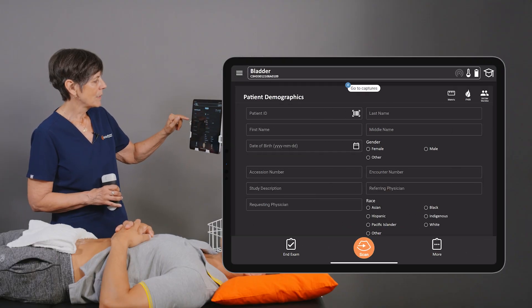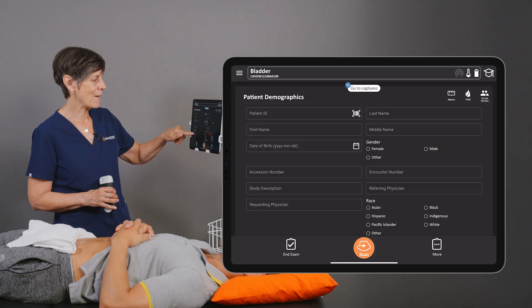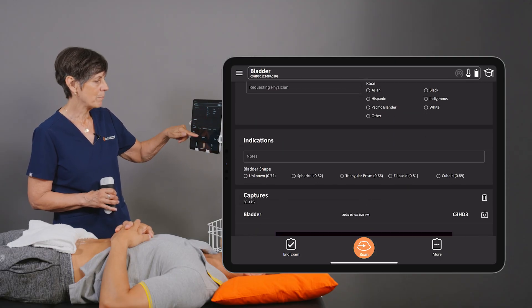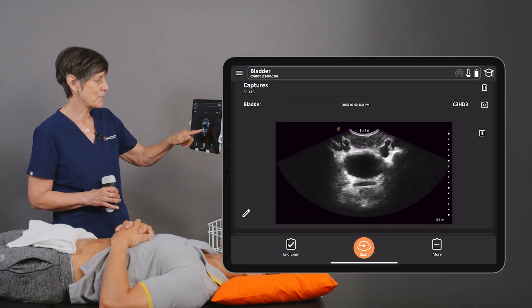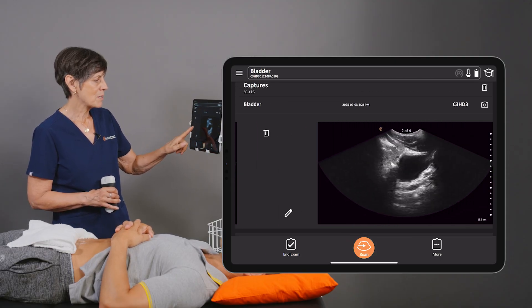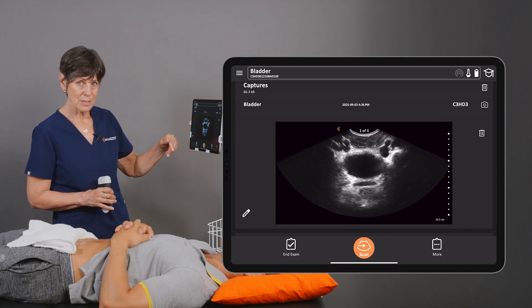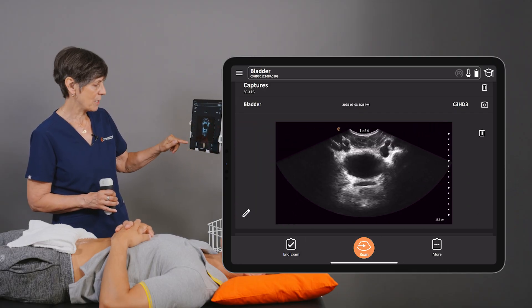To do this, you just have to go back to the patient demographics page and scroll up and find the images that you want to use. I've already taken a transverse and sagittal bladder image here.